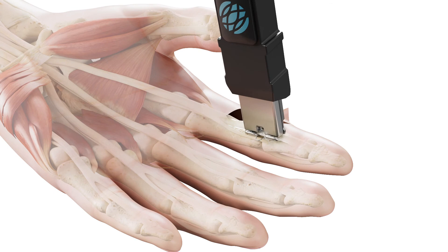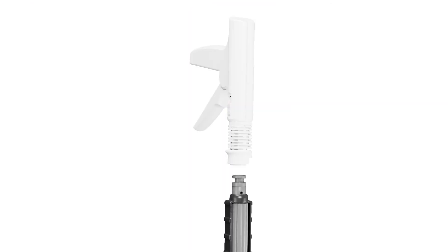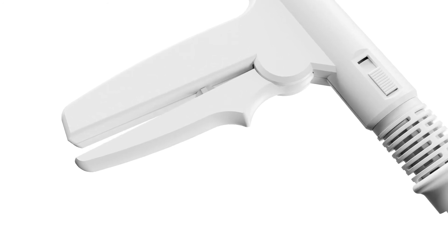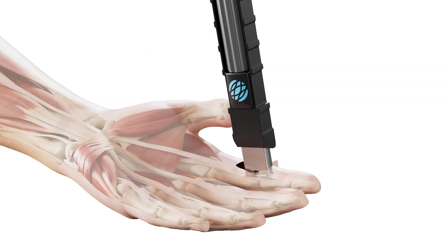When the tendon is appropriately aligned and engaged, attach the deployment mechanism to the implant mechanism and pull the trigger to deploy the implant. The trigger will release back to its original position when the implant has been fully deployed.